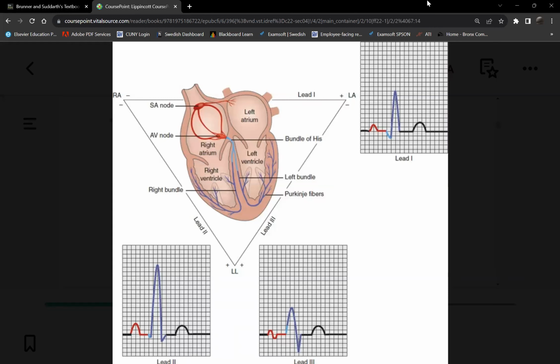So you have the heart there. Imagine you have somebody's head on top of that heart, and there are two lungs on each side, a right lung and a left lung. And over the corners where you see that upside down triangle, over those two top corners are the patient's shoulders. And then the patient's torso, of course, is where the heart is located, and then we've got the right leg and the left leg.